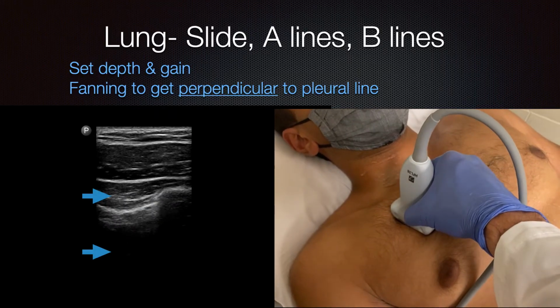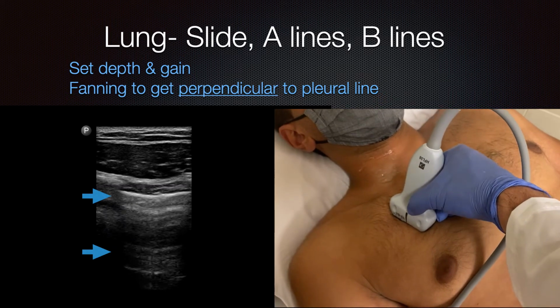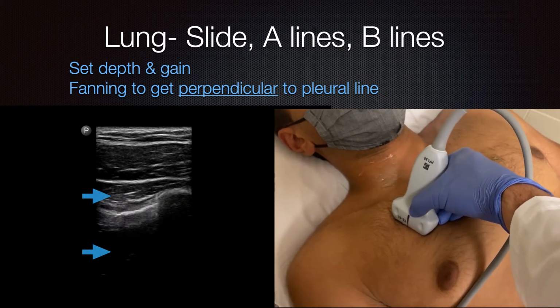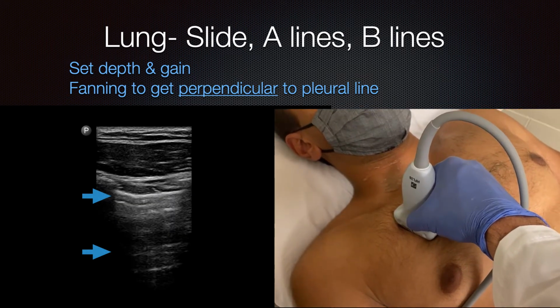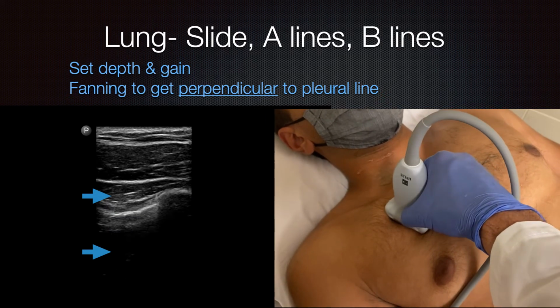So looking for lung slide, initially you can see here we're fanning the probe back and forth. You want to be exactly perpendicular with the pleural line to be able to see it brightly and to get other things out like A lines later. And you'll notice that the pleural line kind of dives deep and then comes more towards the surface when you're truly perpendicular with it.